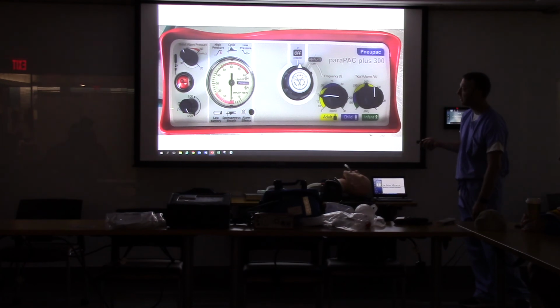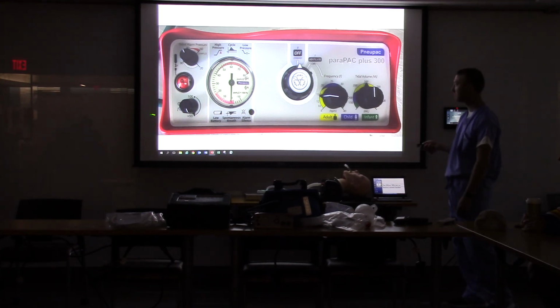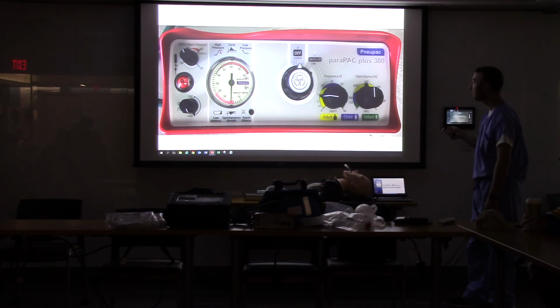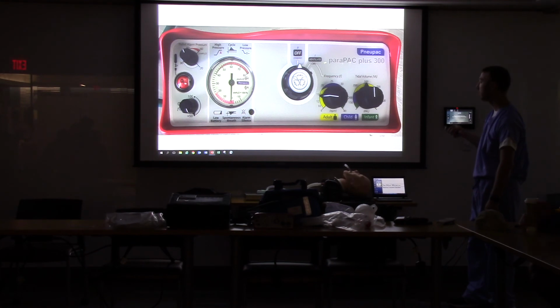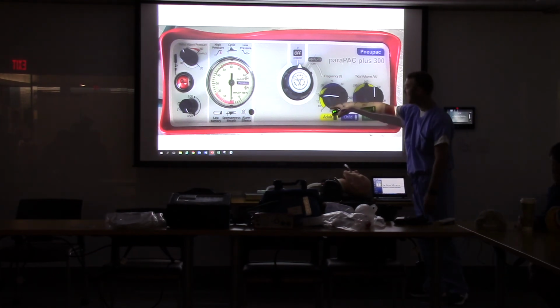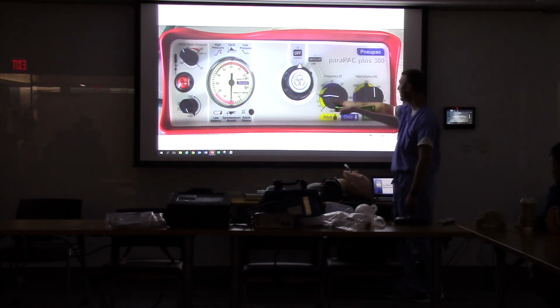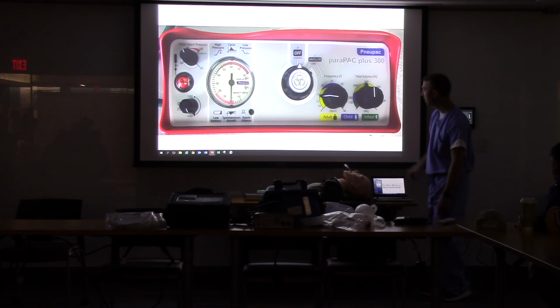And then down here is your FiO2. You either have 100 or 50. Generally, most patients do not need 100, so use as little oxygen as possible. You can see here this is control mechanical ventilation, so it just does control at whatever this is, the breath rate. So most patients need between like 15 to 20 breaths a minute at smaller volumes.